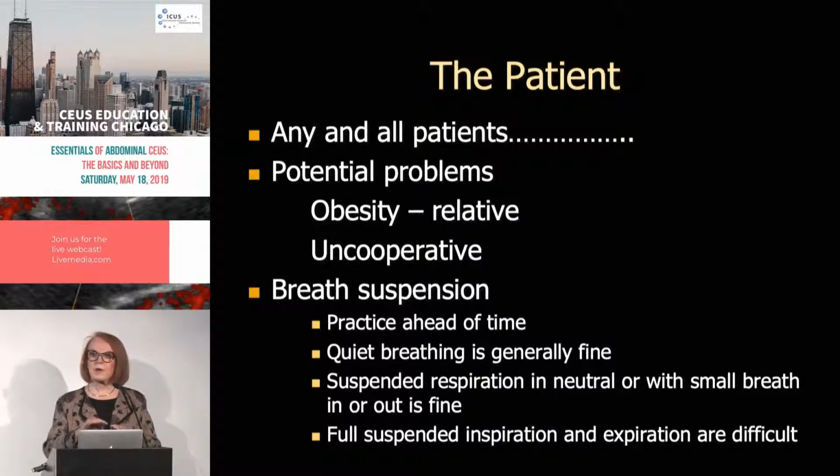And if you want them to breathe just normally, you have to tell them you don't want them to change their breathing. Otherwise, as soon as they hear you say, inject now, and then the nurse says, injecting, end of injection, starting flush, the patient's heart starts to beat faster, they start to breathe faster. You've got to practice so that they know.